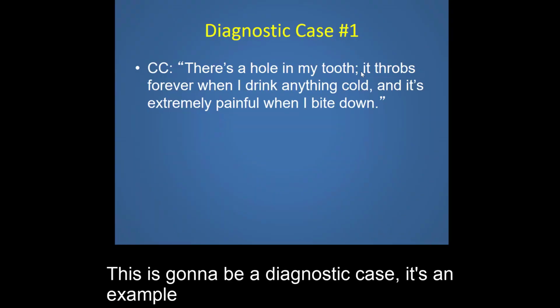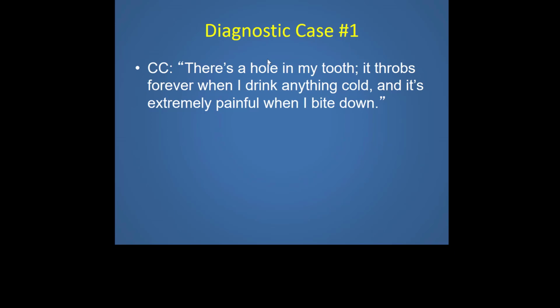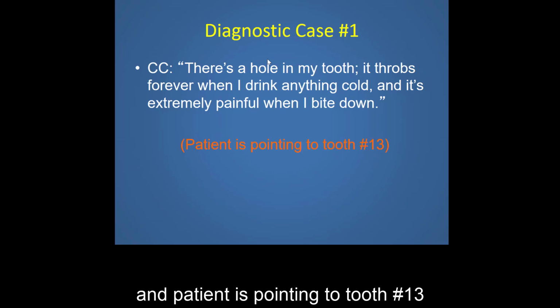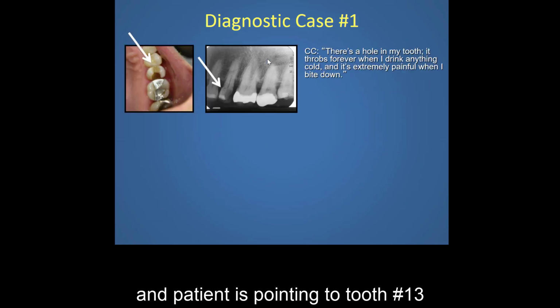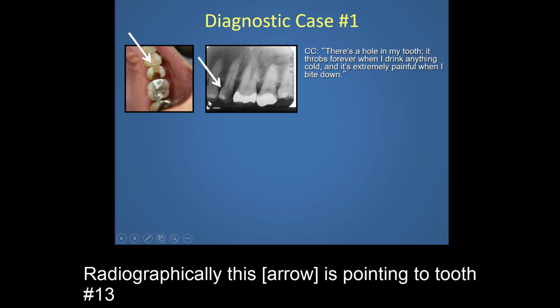This is going to be a diagnostic case. It's an example just as practice. Okay, the patient comes in with a chief complaint saying there's a hole in my tooth, it throbs forever when I drink anything cold, and it's extremely painful when I bite down. Patient is pointing to tooth number 13. As you can see, tooth number 13 has this large cavity.